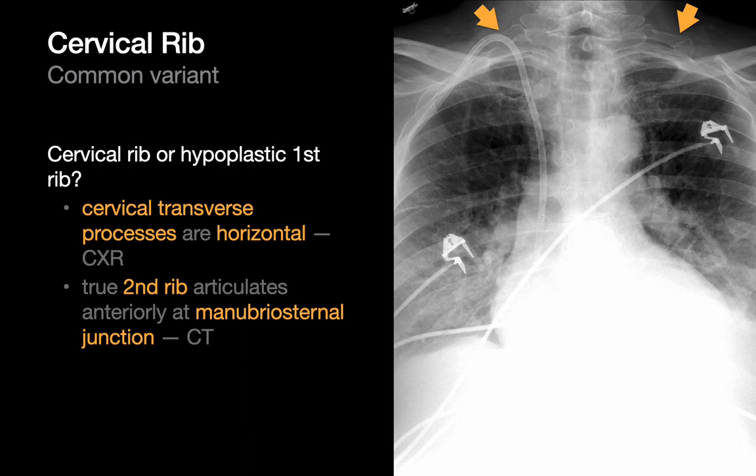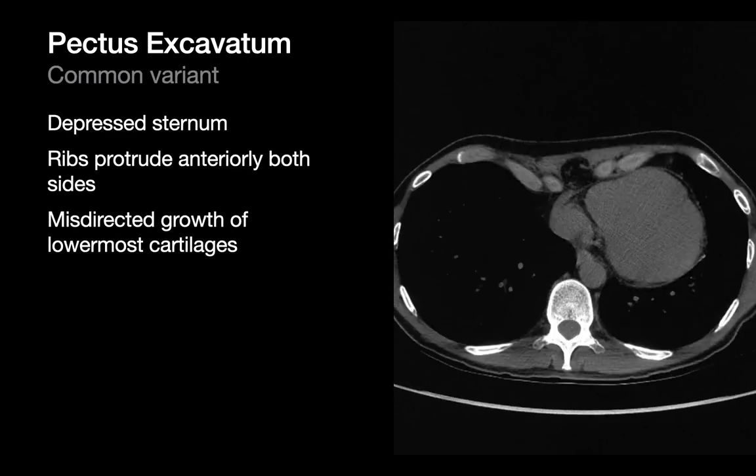On chest CTs you can use the manubrosternal junction as a landmark, since you usually won't have the dens on your chest CT volume. True second ribs generally articulate with the manubrosternal junction, and that will help you figure out if the rib you're looking at is a first rib or not.